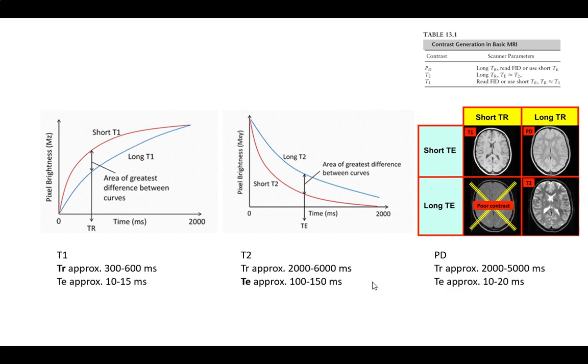That is really big compared to this. But remember, in this one we had a much weaker signal because we weren't dealing with the full T2. We were dealing with a T1 that decayed and then kicked into T2, so it's kind of twice decayed. It wasn't a very strong thing, so we needed it quick. On this one, I'm trying to get them to spread because I want the T2 dynamics to be what matters. The T1 dynamics don't matter much at all. I really care about what energy came into it. So we set that about 100 to 150 milliseconds.